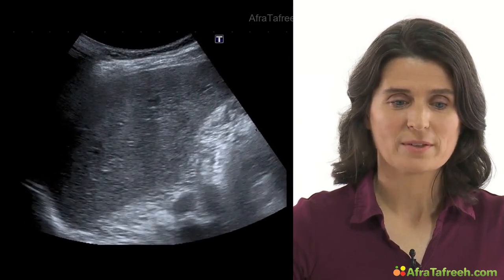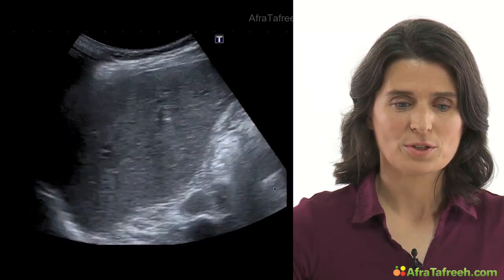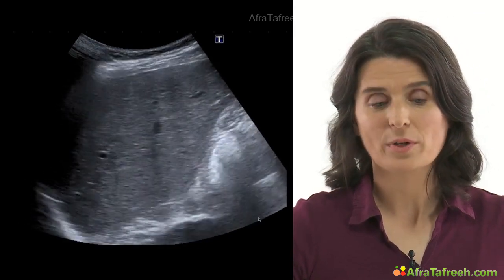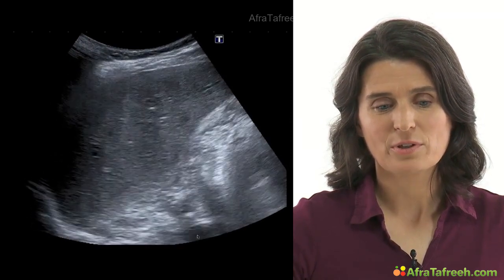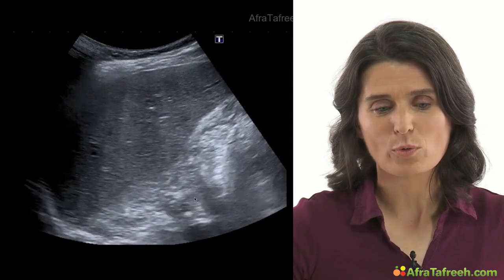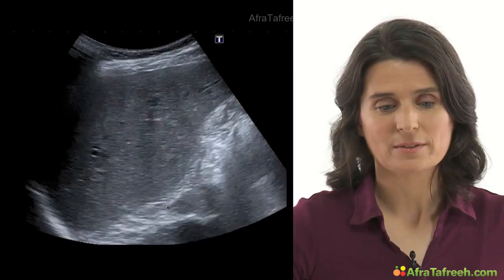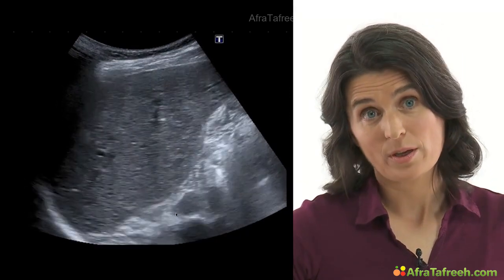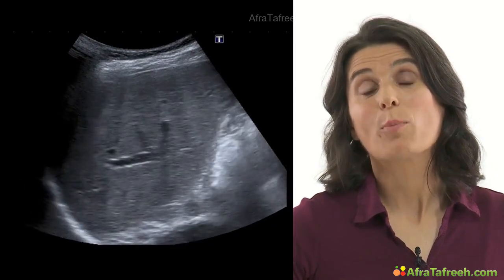Got the right liver lobe over here. It should be the right kidney. We can't detect it now because there's a lot of colon gas, but this is the right region. Here we got the inferior vena cava. And there is something, a small round object in the area of the right adrenal gland. So this is highly suspicious of an adenoma and maybe the reason for the problems of our patient.